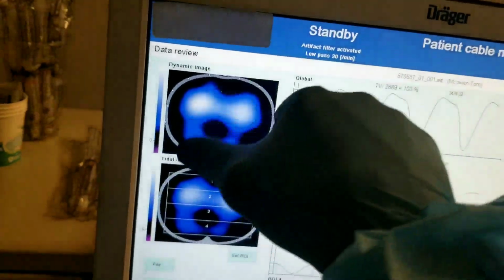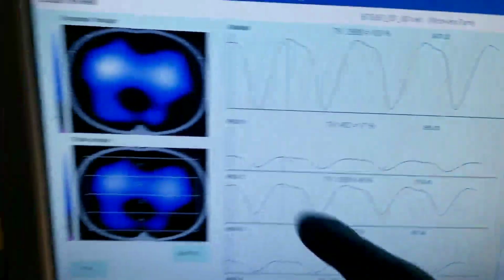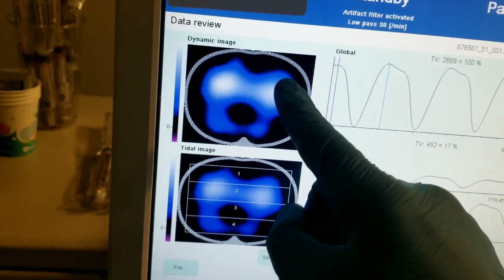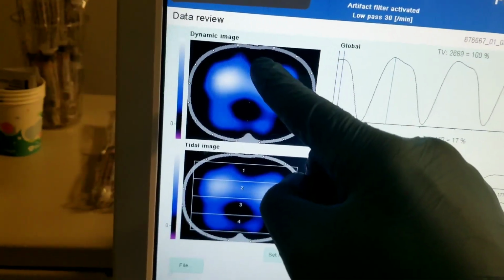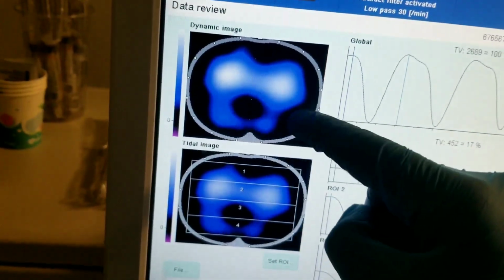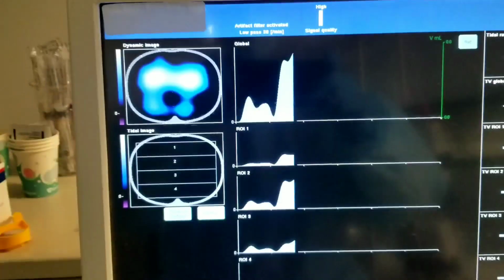So what we're going to do is prone the patient. It's well indicated because the FiO2 is quite high, and by flipping him, we know that there's good ventilation here, so that'll redistribute the blood over here. It'll kind of splint this area and hopefully keep it recruited. So that's where we're at this moment.